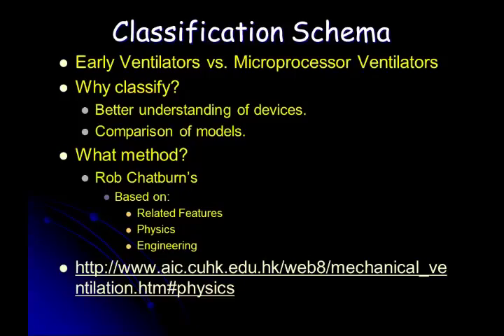So we need to have some way to understand this. So when I say something is flow controlled, you know exactly what I'm talking about. Okay? And that way we can compare what one manufacturer calls one thing and another manufacturer gives the same exact thing a totally different name. But if we're all thinking about the same way of classifying it, it makes sense.